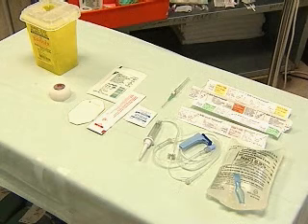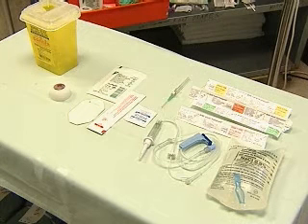It's quite simple to set up an intravenous line, but there are a few tips that can make the job easier.